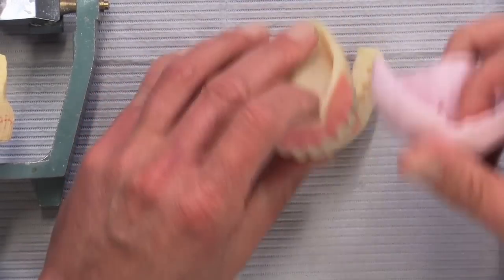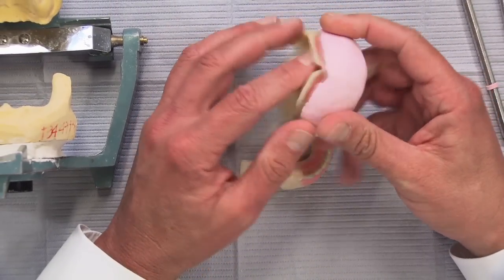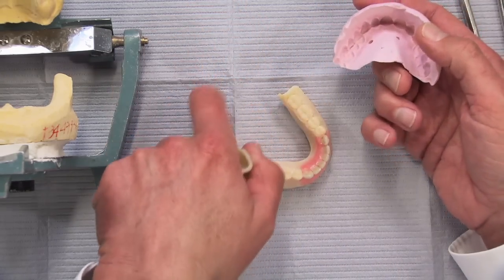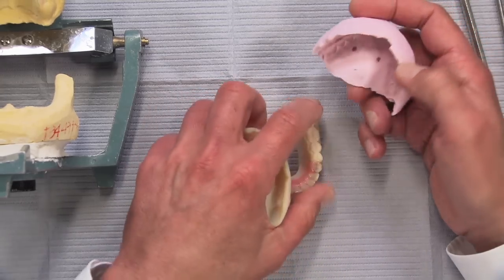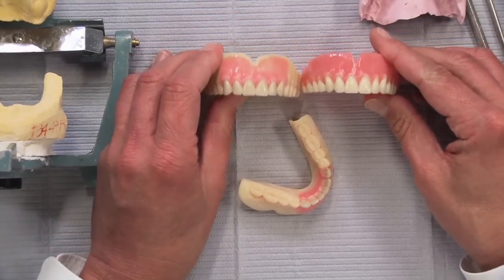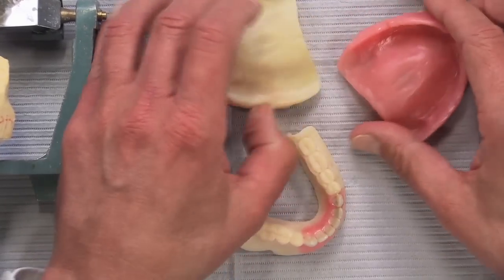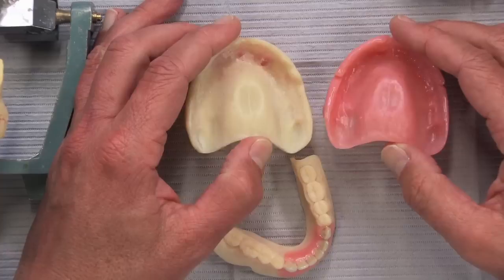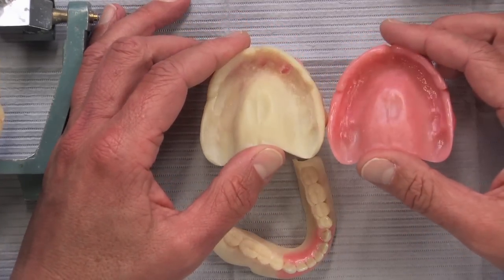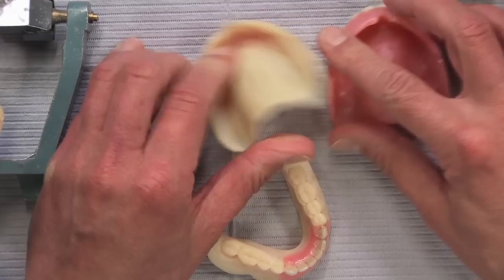We're actually going to duplicate it at that point using hydrocolloid in a flask. We duplicate it with the hydrocolloid, set the teeth into it, and then put the regular denture material into the flask. What we end up with is an exact replication of what you had in the patient's mouth, except now it's in the typical pink acrylic that we're all used to seeing — with all the same contours, everything the same as the printed resin base.